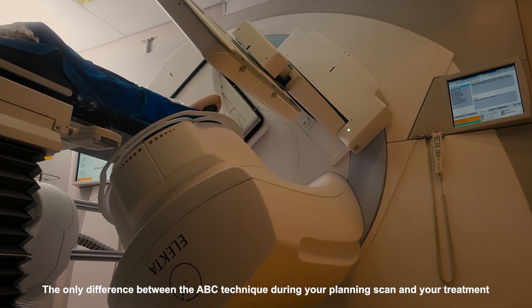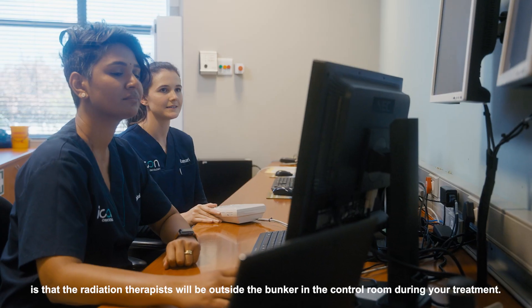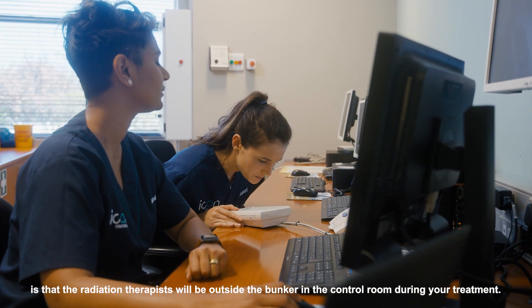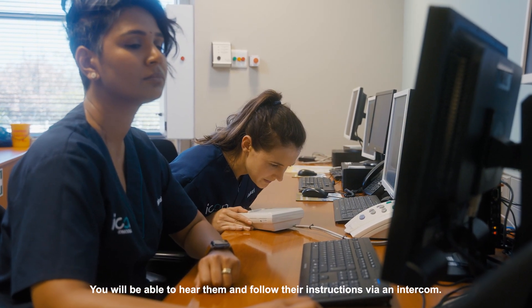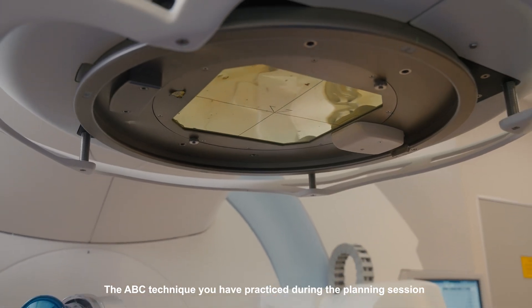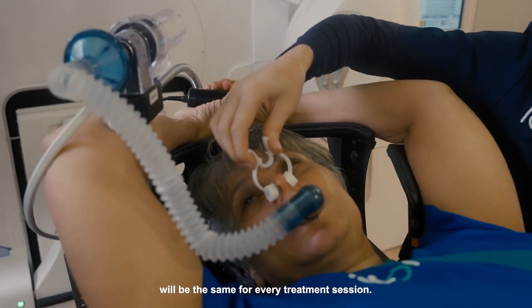The only difference between the ABC technique during your planning scan and your treatment is that the radiation therapists will be outside the bunker in the control room during your treatment. You will be able to hear them and follow the instructions via the intercom. The ABC technique you have practiced during the planning session will be the same for every treatment session.